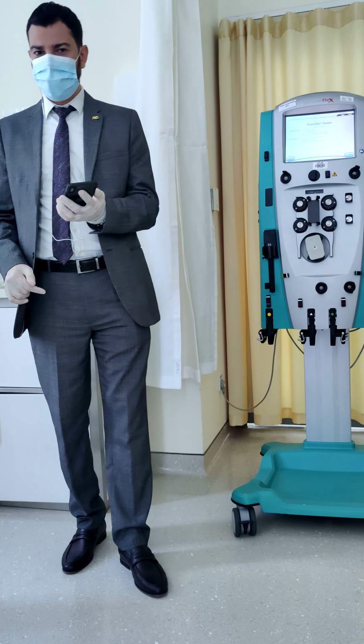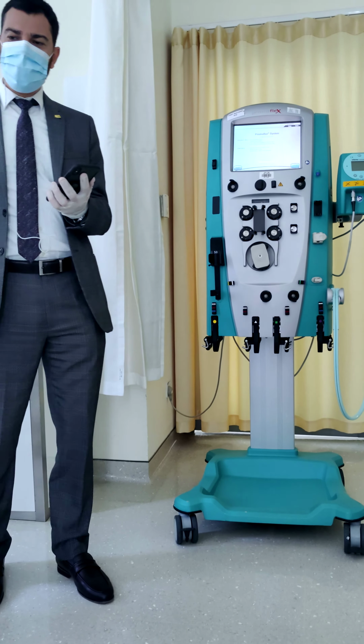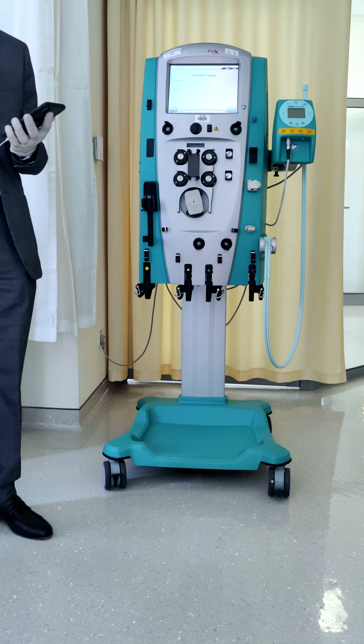Perfect. All done? Yes. Okay, perfect. If I need a total exchange of 100%, it means I need 3.6 liters of plasma.